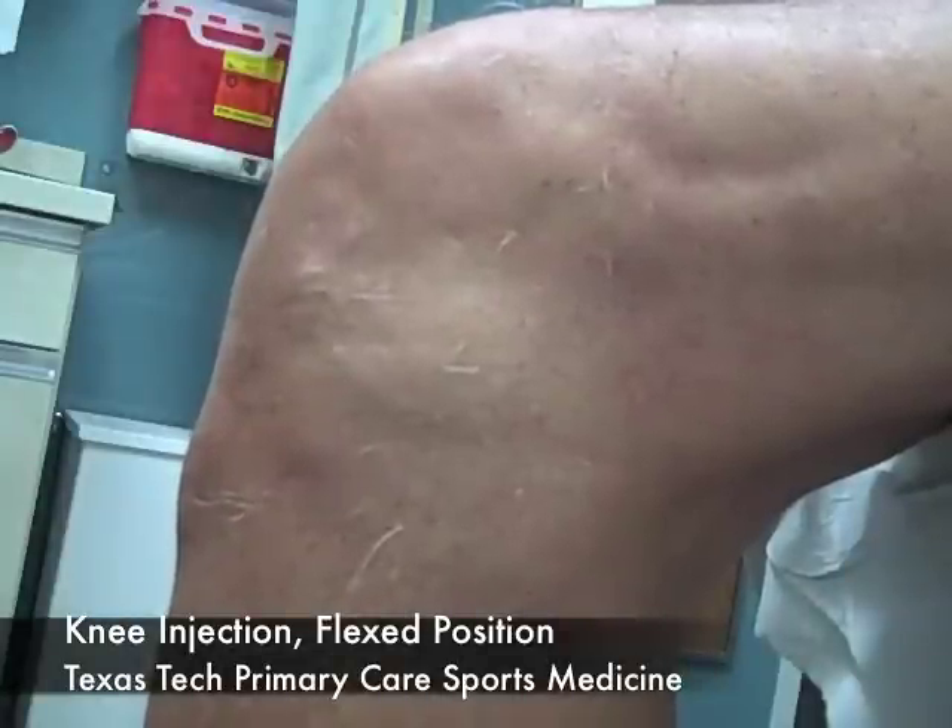Today we're going to demonstrate a technique for an intraarticular knee injection, and we're going to be doing a viscosupplement injection. The main indication today for the procedure is osteoarthritis, and the main goal of the injection is pain relief.